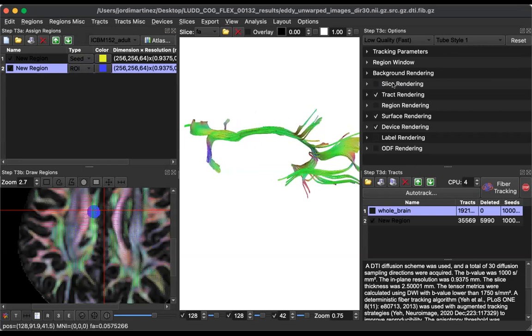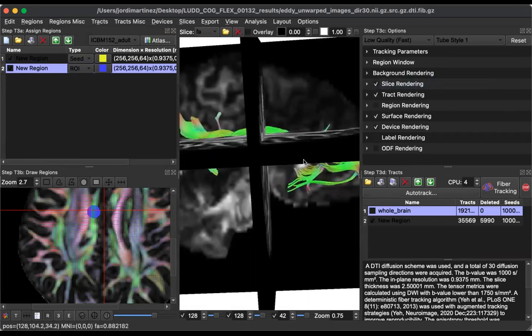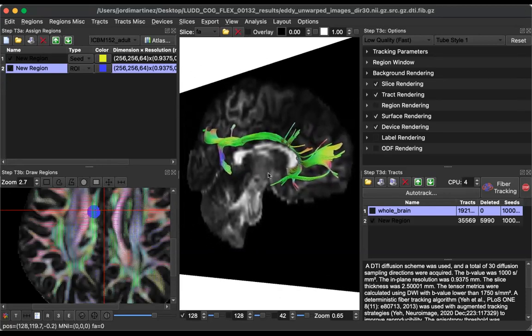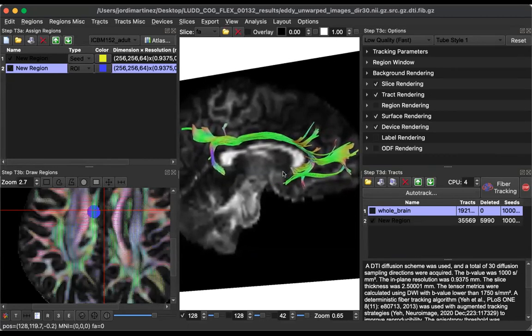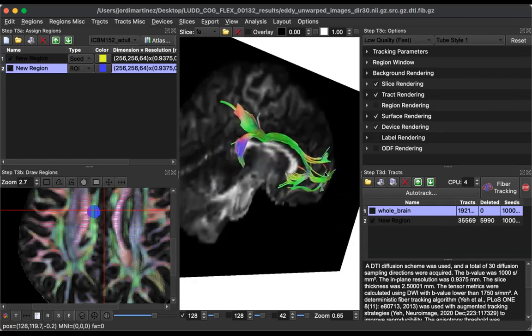Is that one of the normal kids? Yeah, this is one of the normal kids. That's what the cingulum looks like. I did it really quickly. We've done that. Oh, here. Because you can see it on the structure in the back.